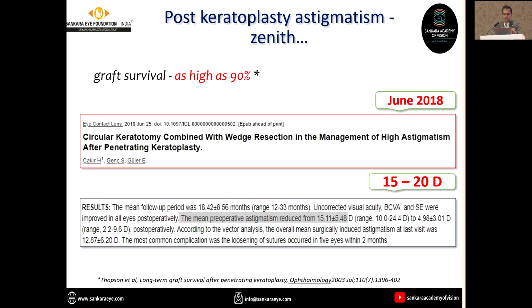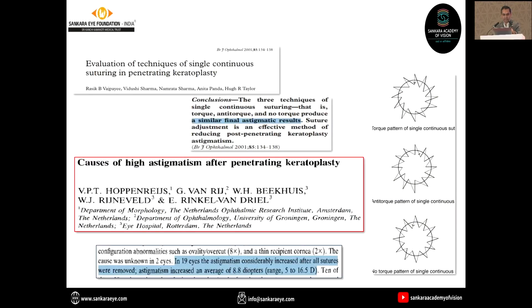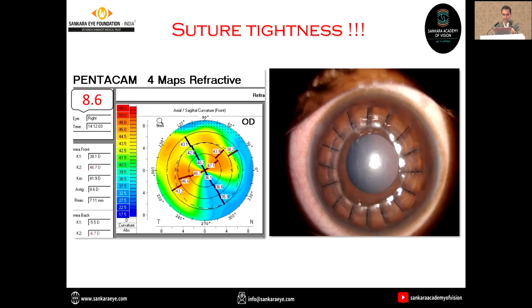In such a situation, obviously the patient is going to have an anatomical outcome, but not a functional outcome. There are many articles discussing how to prevent astigmatism, how it occurs, what the different suturing techniques are, what all we could go for, all sorts of things. The debate has been raging on for decades.